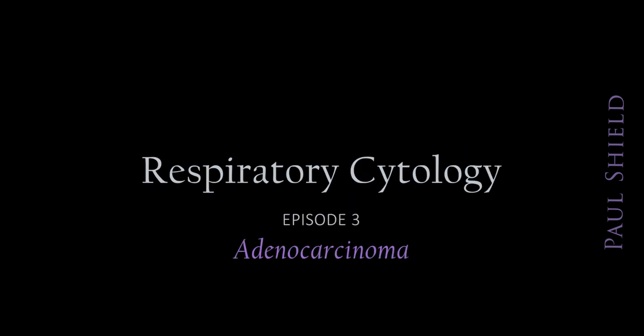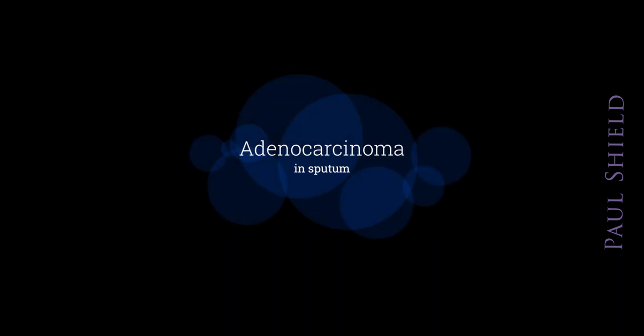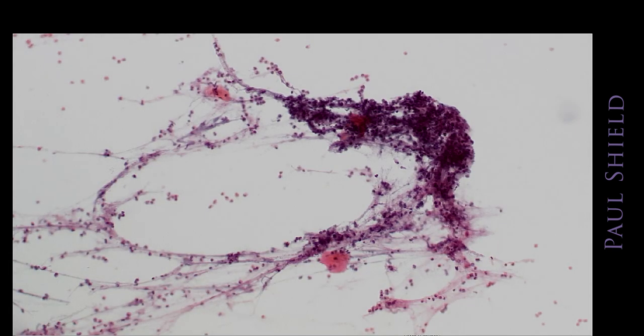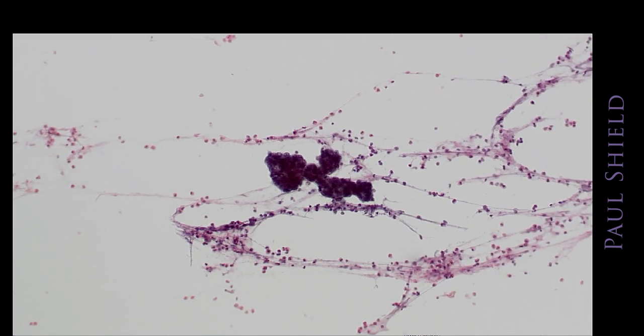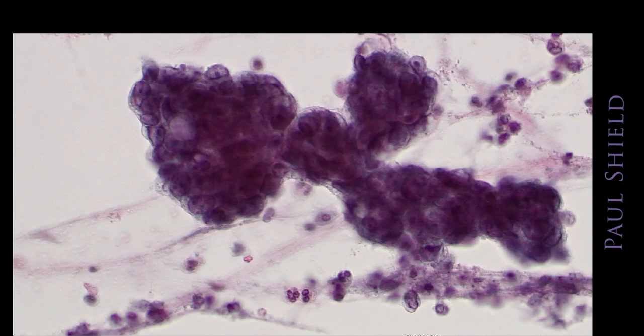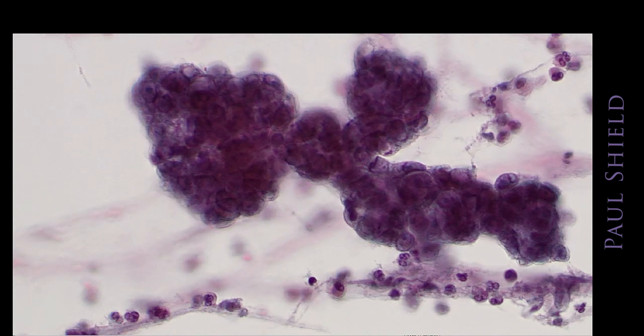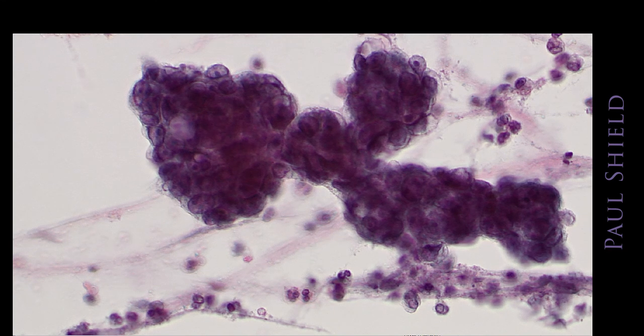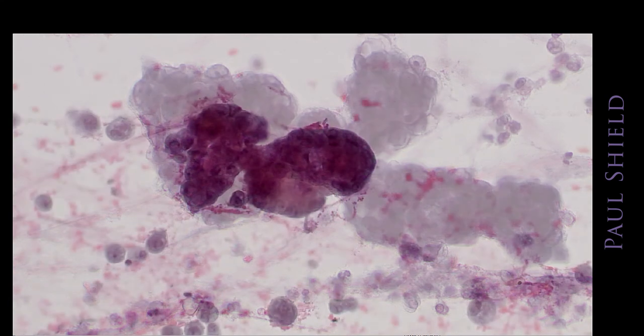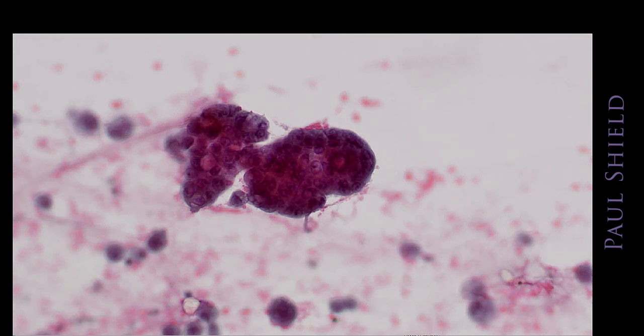Let's look at adenocarcinoma in respiratory specimens. We'll start with sputum. And the classic appearance in sputum is balls of cells that are hyperchromatic. This is a classic example here. You can see the grouping has three-dimensionality to it. You can focus up and down. And on the outside, the nuclei are arranged peripherally. There's like a community border, and I think I can see vacuolation in that group.